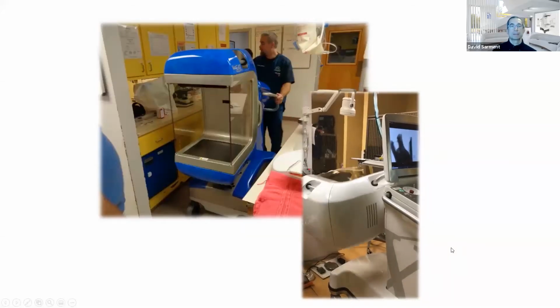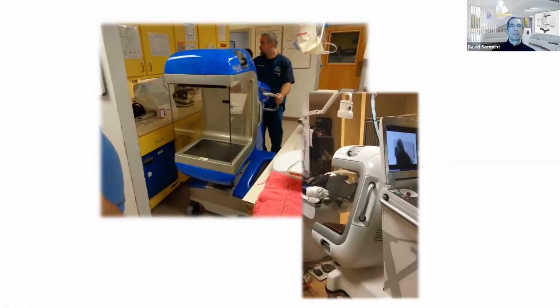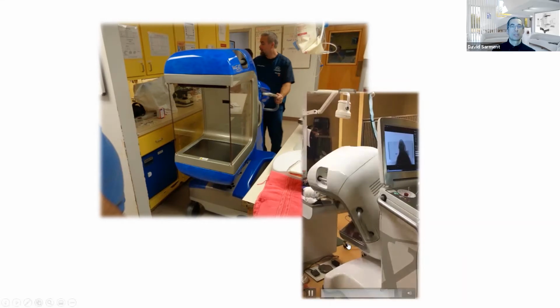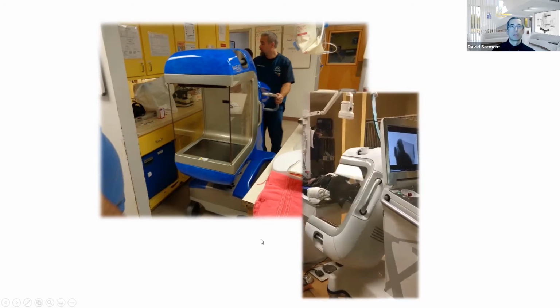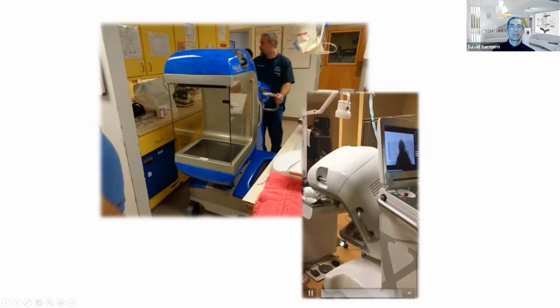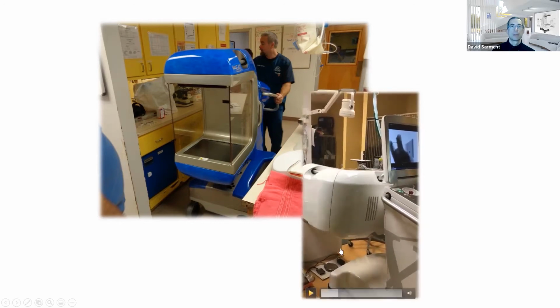And the devices themselves have really simplified. The VetCat in particular, as you can see it here on that quick video, is relatively simple to use. You can move it around the office. It's a big cart. So some of you who just started using the VetCat are very well aware that the practical use of it is relatively straightforward. It's a lot less complex than a full body CT or any sort of older imaging modality that needs a lot of training and a lot of practice to be able to manipulate the device itself. It's still a very complex machine, but it's compact now, it's fast, and the information is almost in real time.